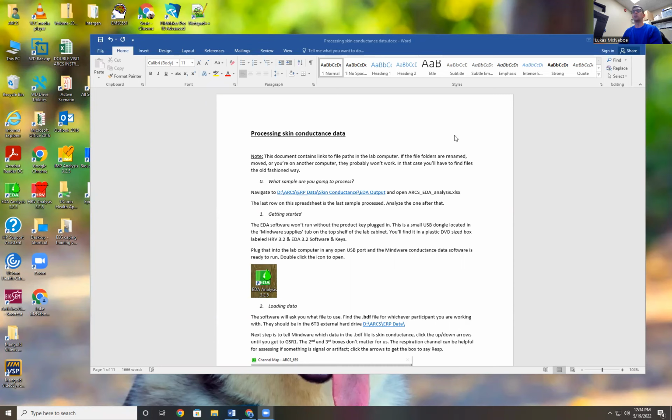Hopefully, I'm sharing my screen and you can see this Word document that we'll just go through step by step. And hopefully this audio is working, so I only have to do this one time. We'll go through it step by step in more or less real time so we can get a sense for how long it takes.